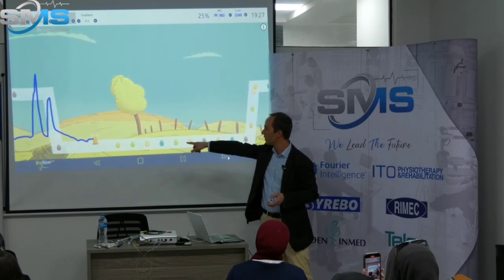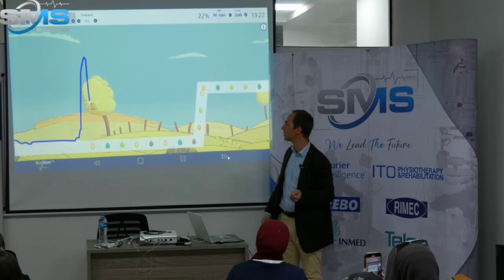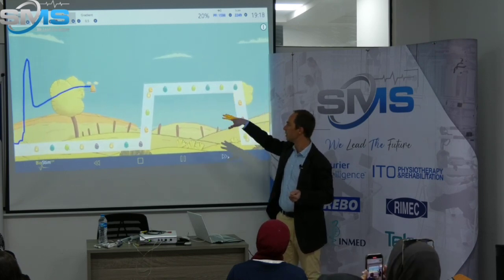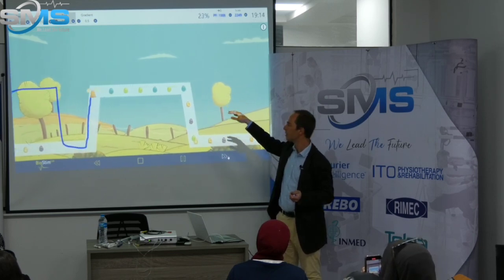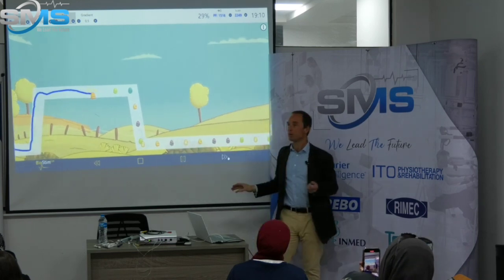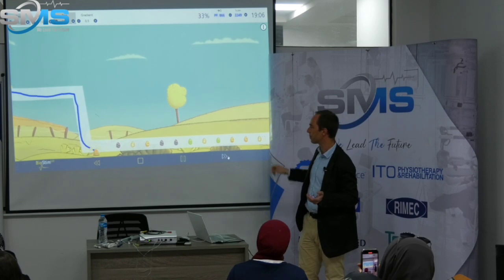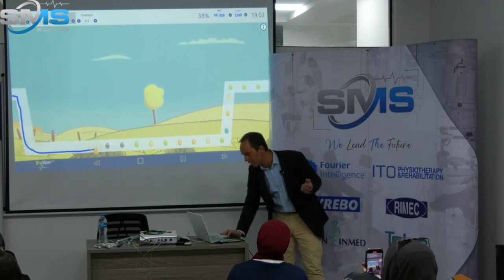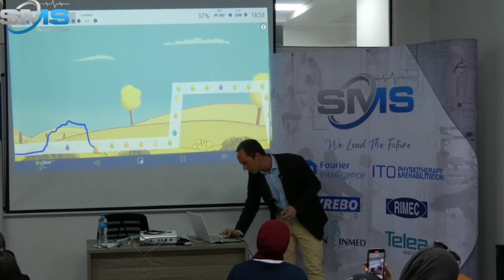And an important point is that you see, the low level is very important. It's not good if your patients stay contracted all the time. A good rehabilitation needs to be able to contract and to relax. If you only contract, it's not good. That's why this rest time is very important, and it must be done correctly. Okay. So I can show you everything, but there are many different animations in order that you can change every time with your patient.